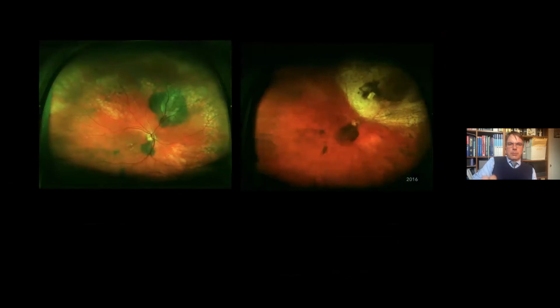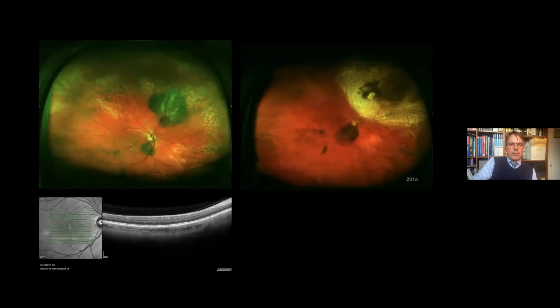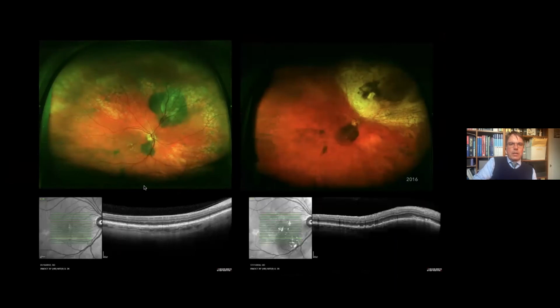And finally, for instance, you can look also at the recurrence or the progression I showed you beforehand. This is the same patient I showed you with the second melanoma growing at the optic disc. And I put the slice at the lower end of the tumor here. And you can see the slice at the lower end during the first examination shows you choroid that is normal with no involvement. And during the follow-up, you can see how the tumor went into and grew into this area there. So we can use that OCT scan also to show you clearly that this has grown at the inferior edge of the tumor. And that's sort of a more objective way of saying the tumor has expanded.